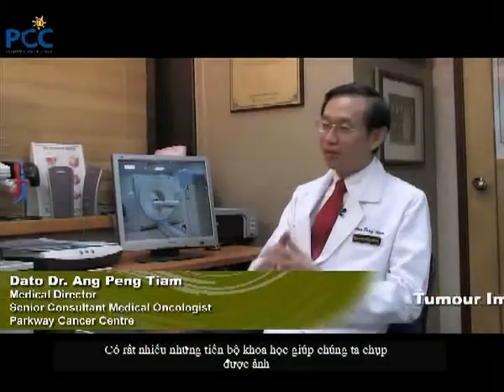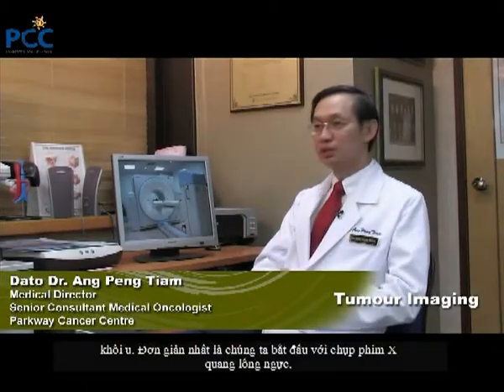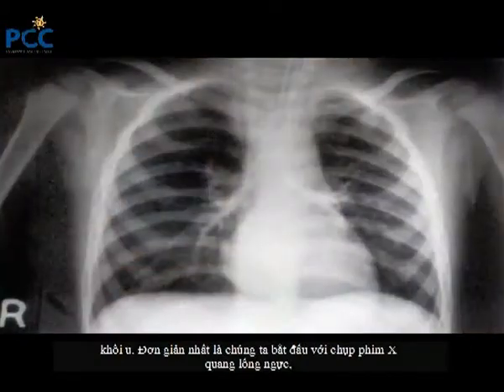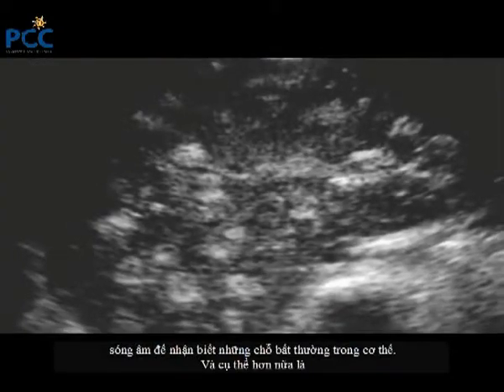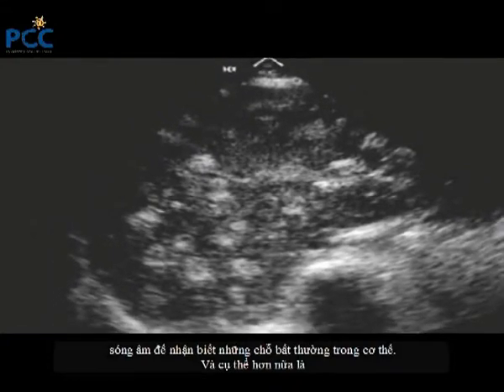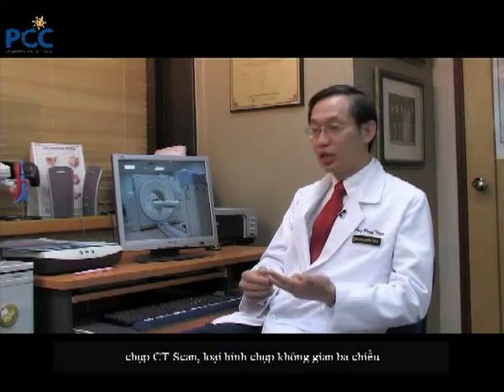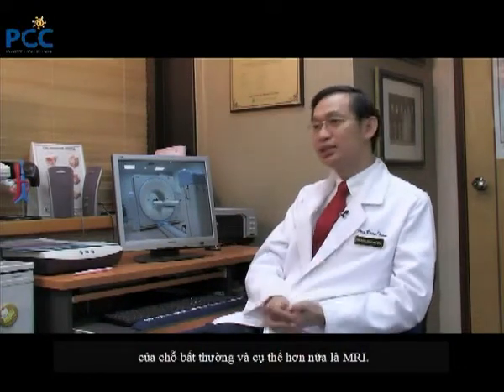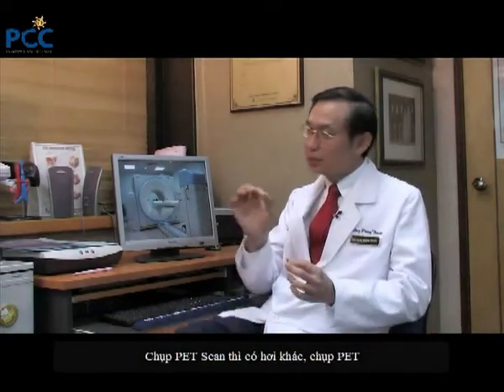There are many advances in the way in which we image tumors. Simply, we start off with things like chest X-ray, plain X-rays. Then later we talk about things like ultrasound, using sound waves to image the abnormality. Then we talk about a CT scan, whereby we can reconstruct, three-dimensionally, what the abnormality is. And then there's an MRI.